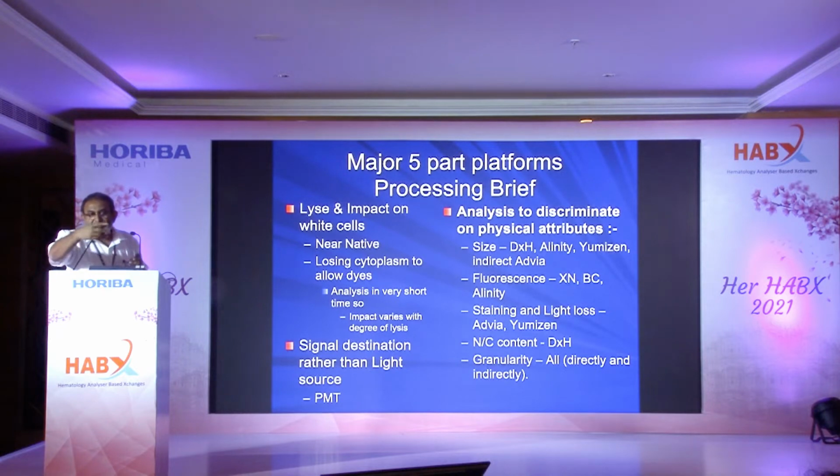You know, I actually gave this talk 2 days back to Abbott, L&T. So I said, okay, maybe you may not consider all 5 platforms as competitors, but for me, all 5 major platforms are equally good. Now, you must realize when they do a differential count, the entire differential count is based on 2 important parameters. One is the way it lyses the red cells, and in the process how the white cells also get lysed, and also the way the light detection after the processing happens is collected.